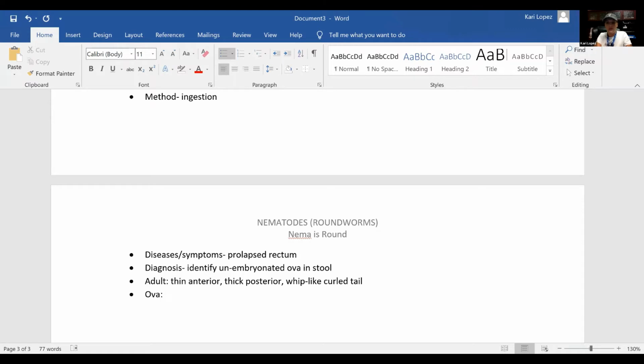The egg. Yep. So your ova is the egg, and then the adult is the worm. So your ova for Trichuris trichiura is barrel-shaped, and that is a key identifying feature that usually comes up on tests as well. So barrel-shaped, has polar plugs, and I'll show you what those are when I show you the pictures as well. And then has a double wall.